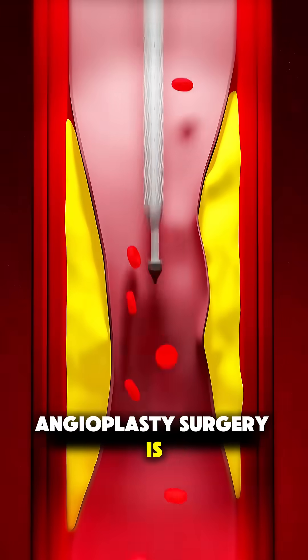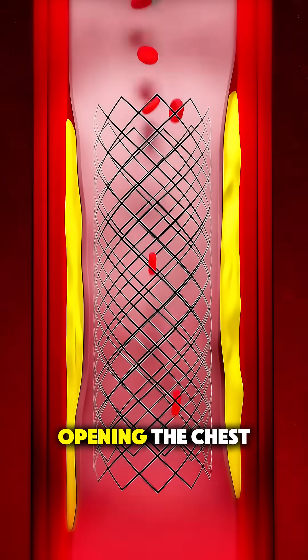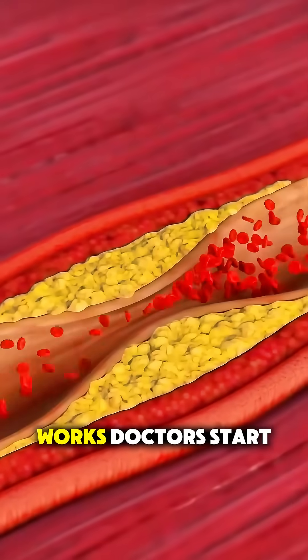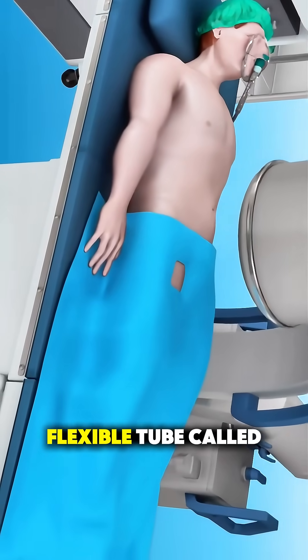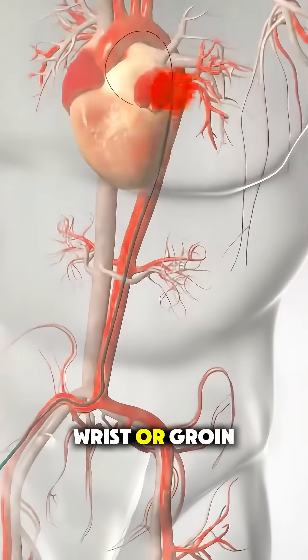Ever wondered how angioplasty surgery is performed? It's actually a life-saving procedure done without even opening the chest. Here's how it works. Doctors start by inserting a thin, flexible tube called a catheter into a blood vessel, usually through the wrist or groin.